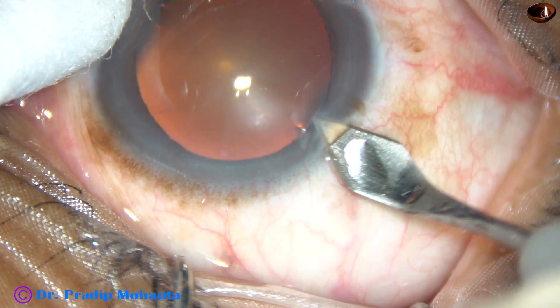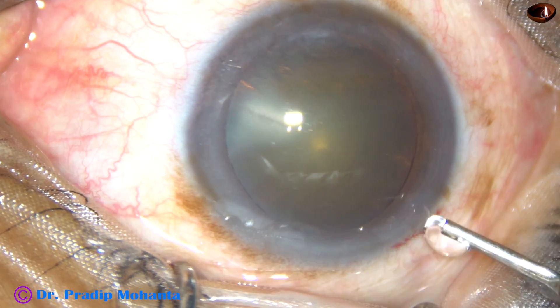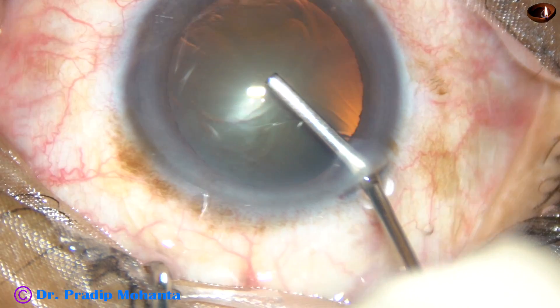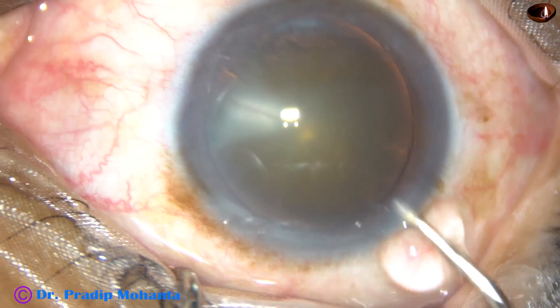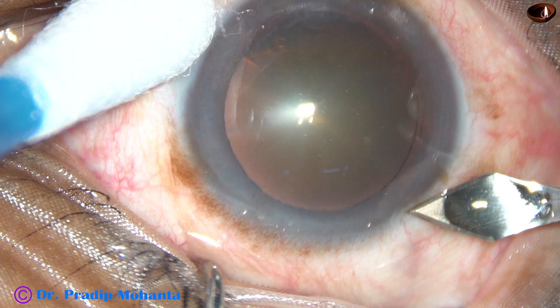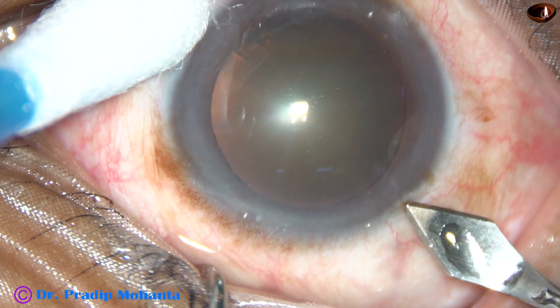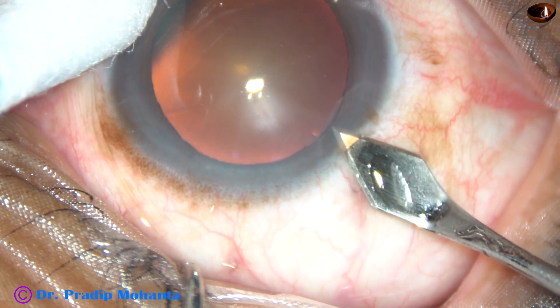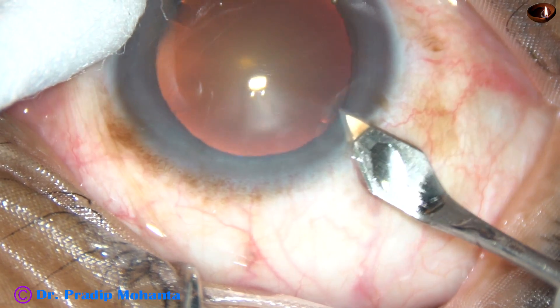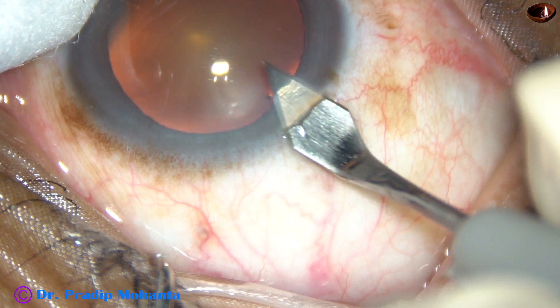This is the main incision — a mid-limbal incision with a 2.8 millimeter keratome. This is 2% viscoelastic. Let us see the incision in slow motion. Make a groove, engage the tip of the keratome in the groove, go forward for some distance and then go downward and enter into the anterior chamber.